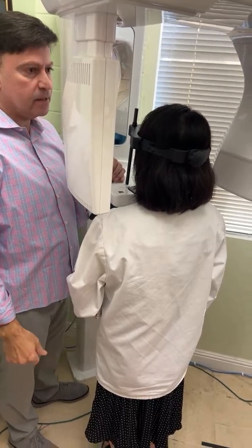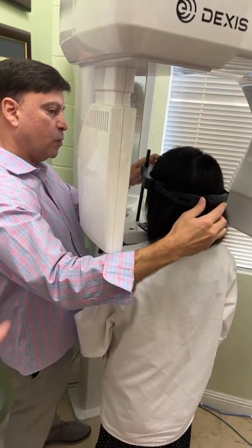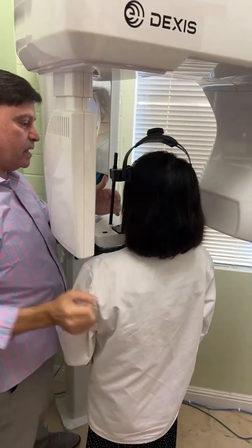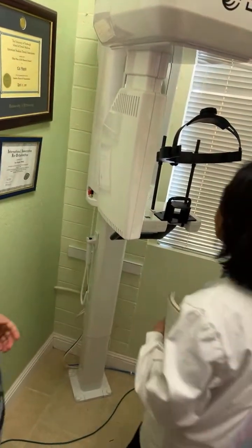Can I take this? I want you to try that right there. Can you release this? Can you test that? I'm gonna open this forward. Go ahead. Can you move around? I want you to test it.